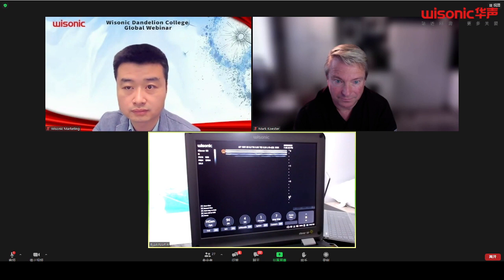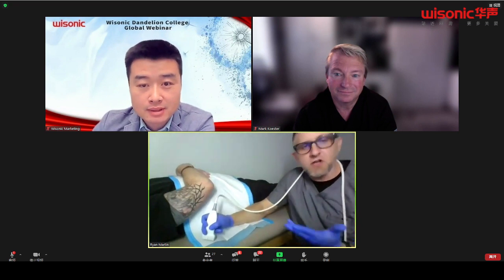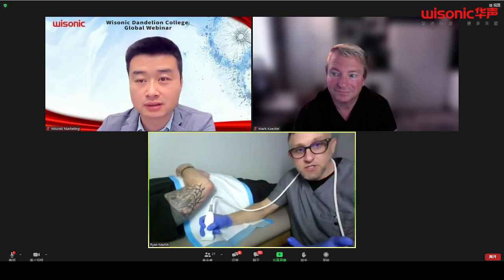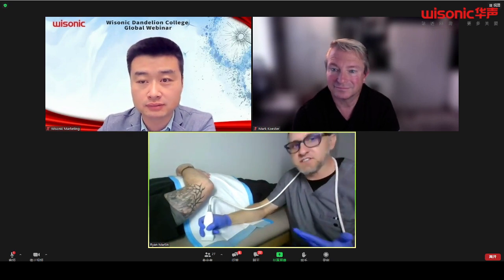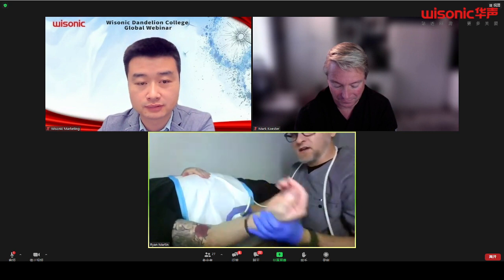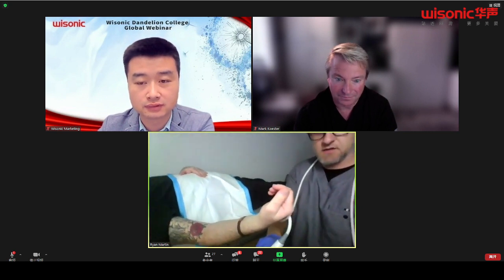Now, since we've gone through most of those areas on this side while it's supine, again, you can do a majority of all your scans right here in this supine position. The only other position that I tend to use is sideline, having the patient face me. Now, here's the thing: if I have my patient bring their arm here, and I have them, let's see if I can bring this back a little bit so we can see a little better.